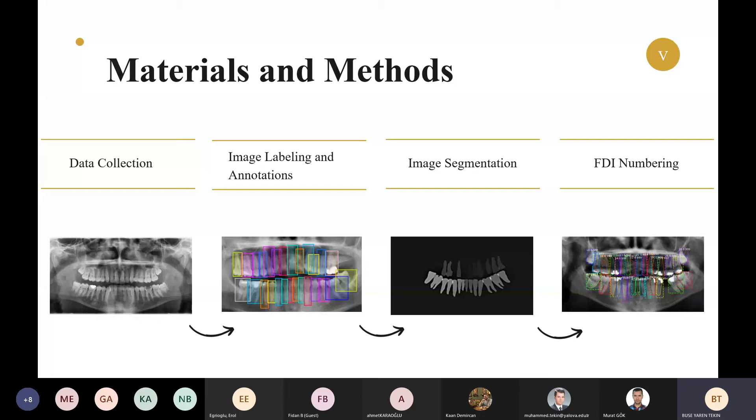In the data labeling stage, data must be labeled and tagged in order to detect objects. In this step, a class assignment is made by drawing the boundaries of the objects to be detected. It's important that additional non-object regions are recognized as background.